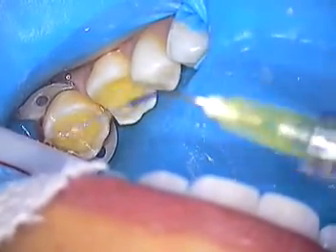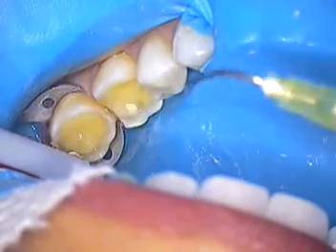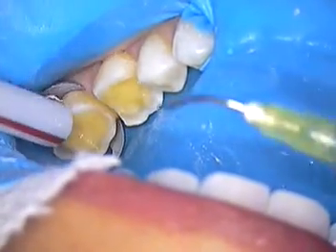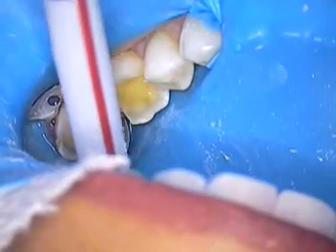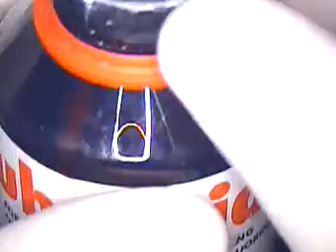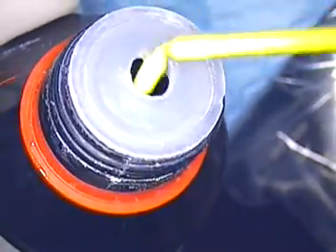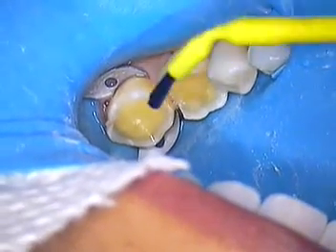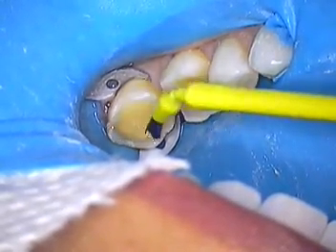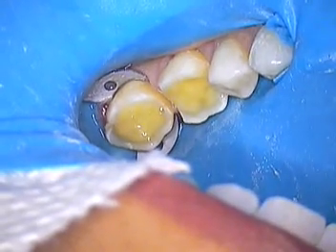Now we'll chelate the surface. Even though we're etching with phosphoric acid, we still want to chelate — we want those dentinal tubules to get unclogged. That yellow material you see, that is dentin, for all you non-dentists out there. We're going to use a product called Tubulacid, which is perfect for unclogging tubules. We just take a sterile Bendex brush, dip it in the top one time — I cut a little hole in the top of the bottle so we don't have to use a pre-comp syringe — and I'm just going to literally dab the material on the dentin. It really does nothing to the enamel, but the dentin is what we want to condition.